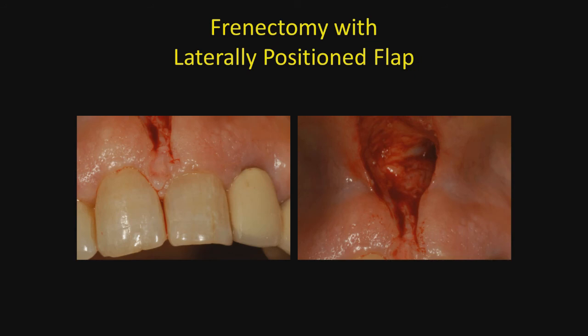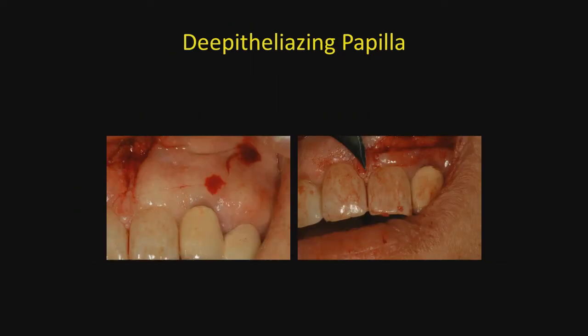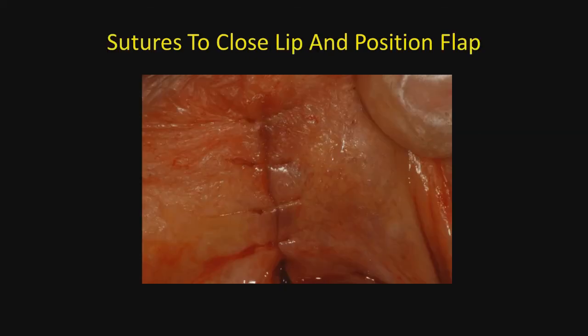So the frenectomy is going to be done with a laterally positioned flap. This has also been called a pedicle flap or a sliding flap, but the proper nomenclature is a laterally positioned flap. And there's a video on here dealing with the nomenclature that should be appropriate for periodontoplastic surgery. And after the frenectomy is done, you will notice on the right where we're going to deepithelialize the papilla without reducing the height. And we will see how that is going to turn out.